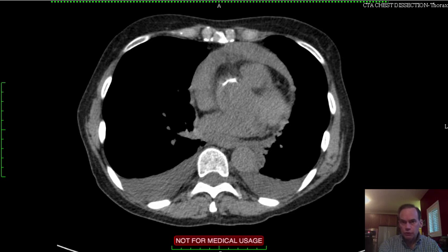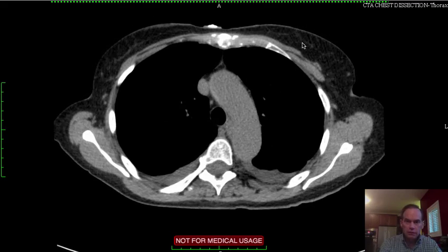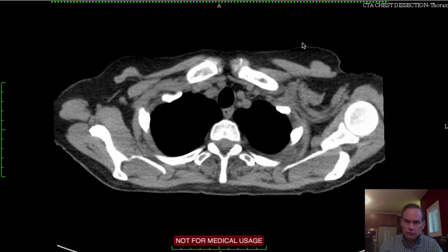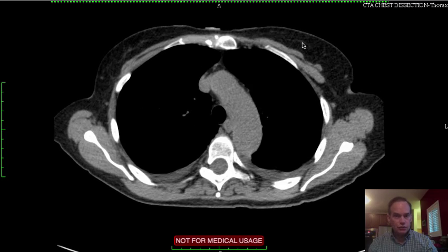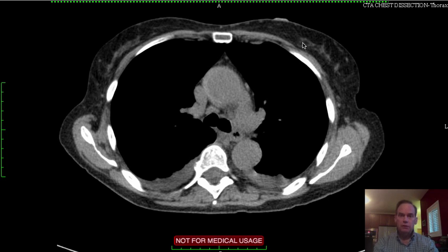about 55 years old. Here are the unenhanced CT images of the chest which were obtained. IV contrast enhanced images also were obtained. Now when we start from the top down, see if something catches your eye. If anything looks abnormal there, that's very good if you can detect this relatively subtle abnormality here.